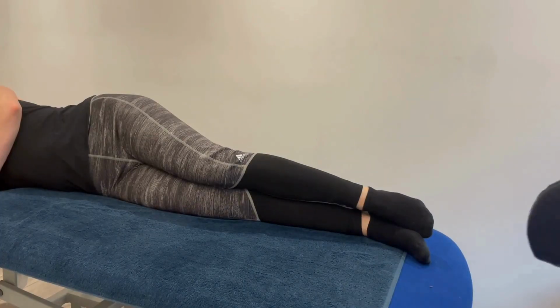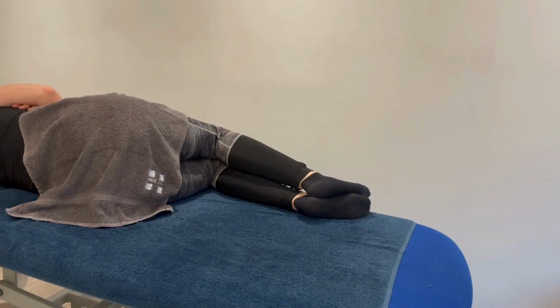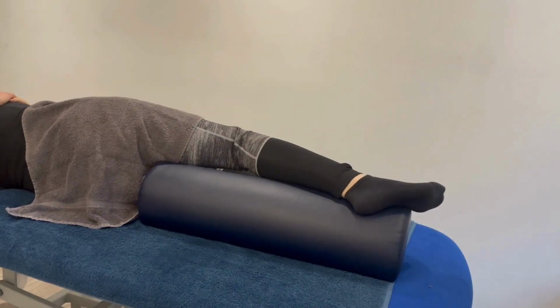The side lying position can allow us to utilize treatments into the lateral and medial portions of the leg a little bit better than perhaps in supine or prone. But how do we put the bolster? There are two ways really to put the bolster. I prefer to do it with the hip flexed, knee bent, leg up on the bolster, but we can also swap that around, so the top leg is straight with the bolster underneath. Individual preference comes into play and also your needs for that particular treatment. So try both and see what works for you.